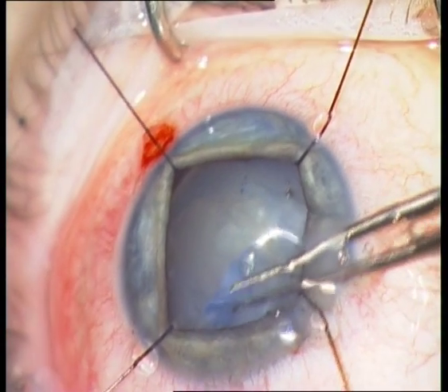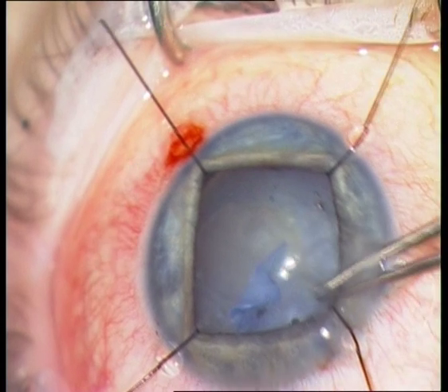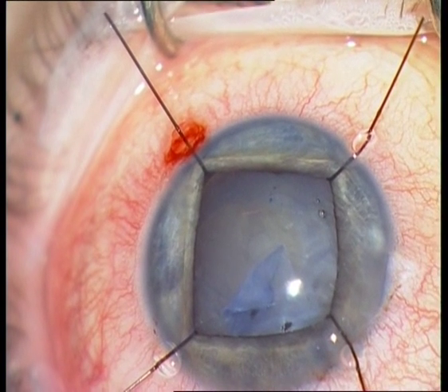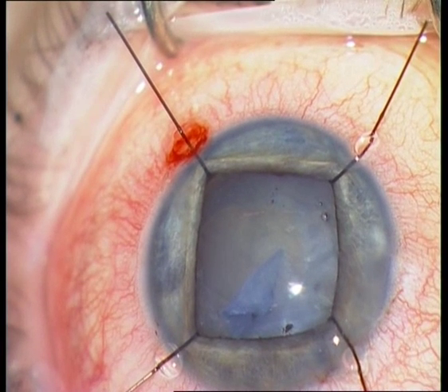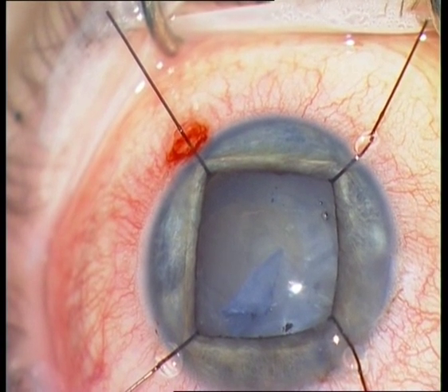Do not use force when performing the rhexis. You will only destroy the capsule, which you need for implantation of the IOL.